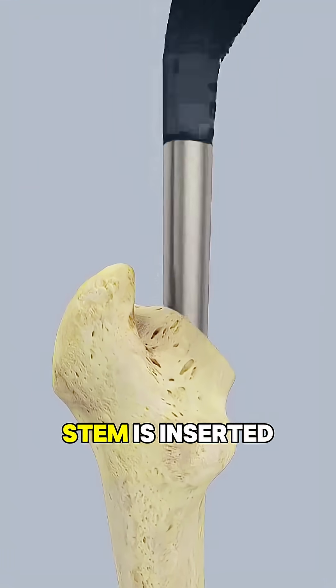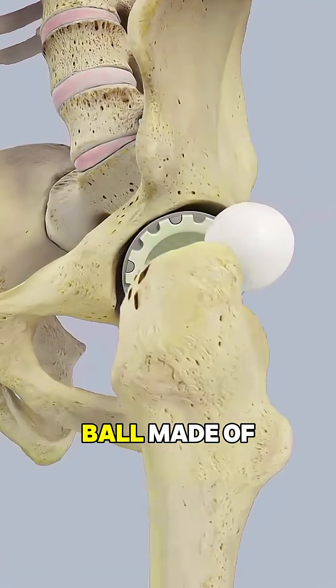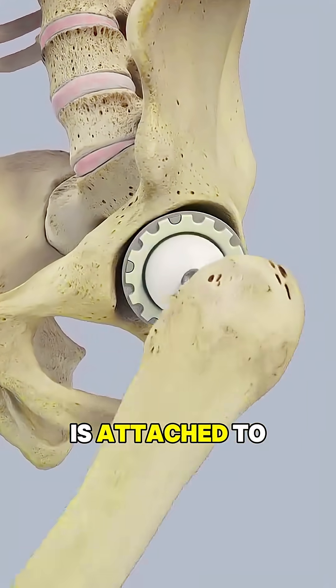Next, a metal stem is inserted into the hollow center of the thigh bone, and a new ball made of metal or ceramic is attached to the top.